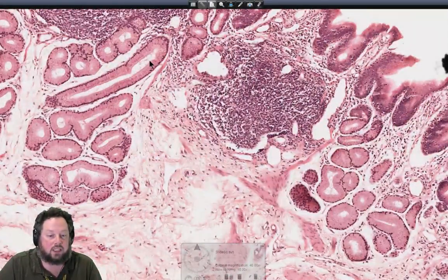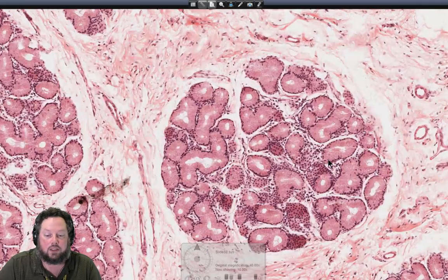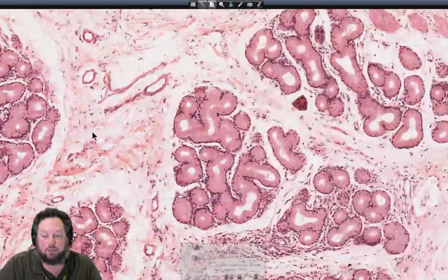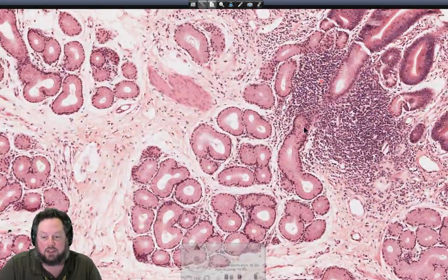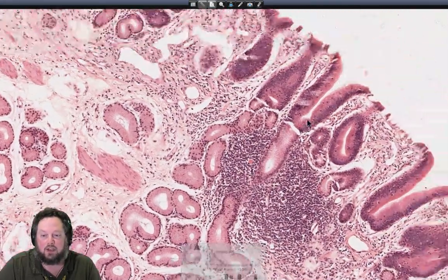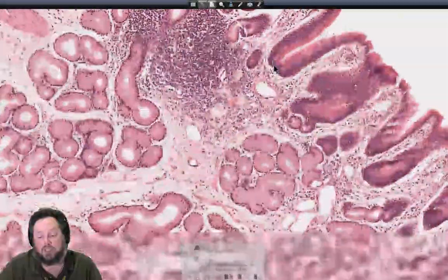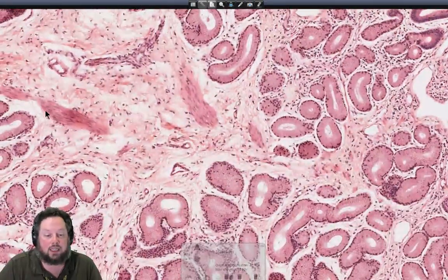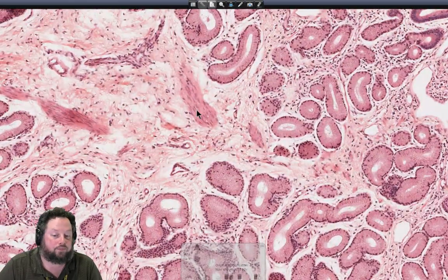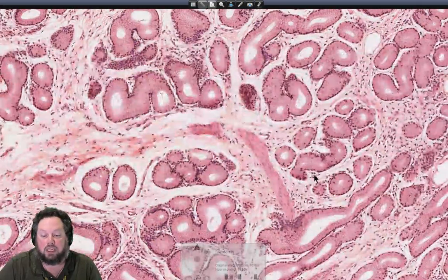So nice glands here, nice lumen present here, and then you can see them again, once again, further down in the submucosa. And we often see their ducts. You can see them sort of emptying into the base of the gastric pits here, and then eventually these will empty into the base of the intestinal glands. Again, you can see that in this region the muscularis mucosa is quite disrupted, because we've got so many of these glands sort of making their way through.